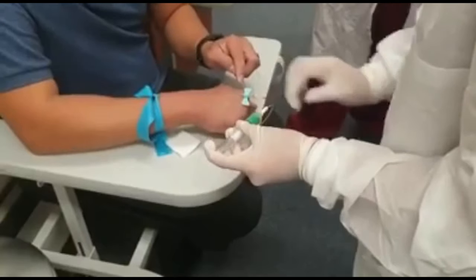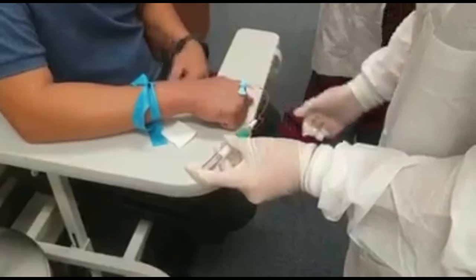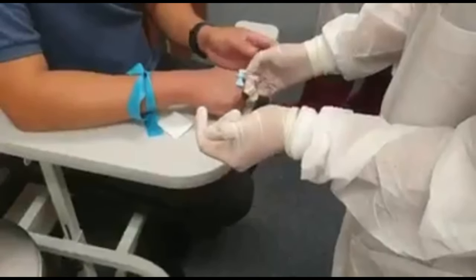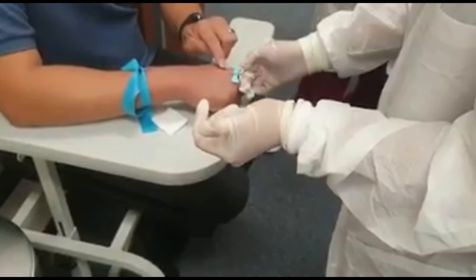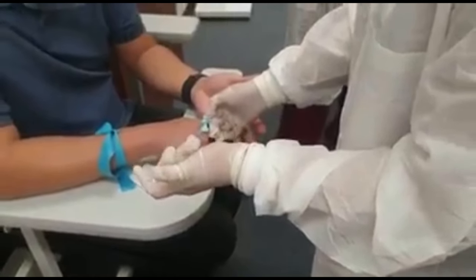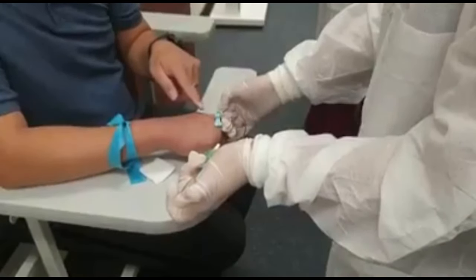And then at this point, since it's flowing, you can actually pick it up a bit. There you go. See how you pick it up? Hold it up. Just slightly there. When you're holding it, if it's hanging downwards, the bevel is against the wall. So if you raise it slightly, like what you did, it should flow much faster. Let's raise it a little bit higher. Is it flowing a bit faster? Yeah, because you raised it just a bit.